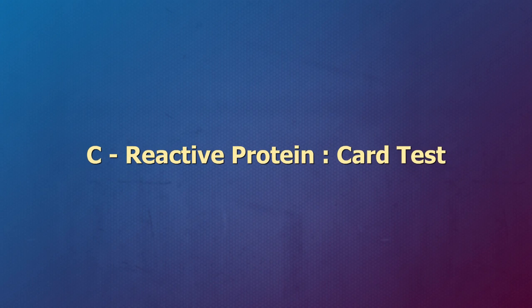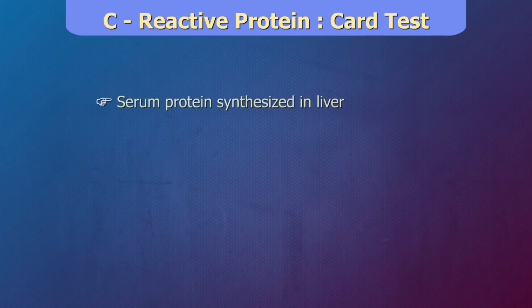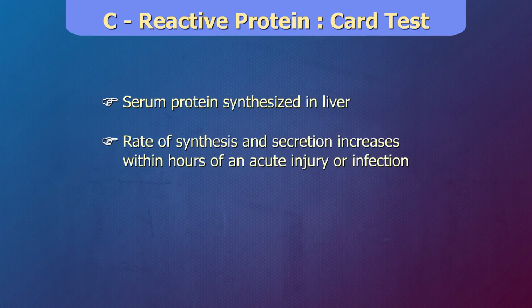C-reactive protein, CARD test. C-reactive protein is a serum protein which is synthesized in the liver. Its rate of synthesis and secretion increases within hours of an acute injury or the onset of inflammation.